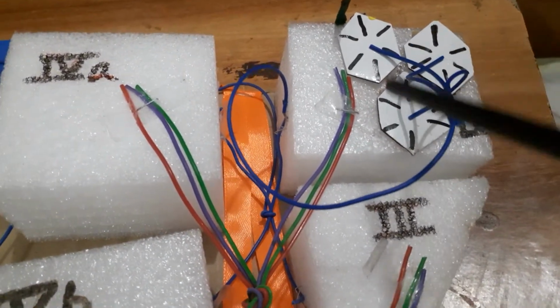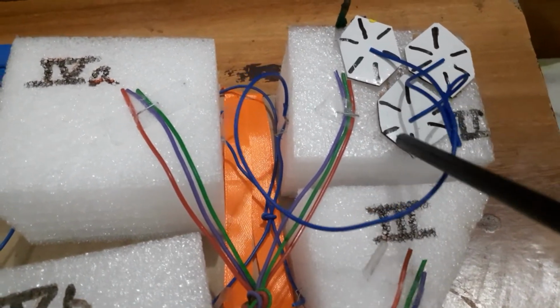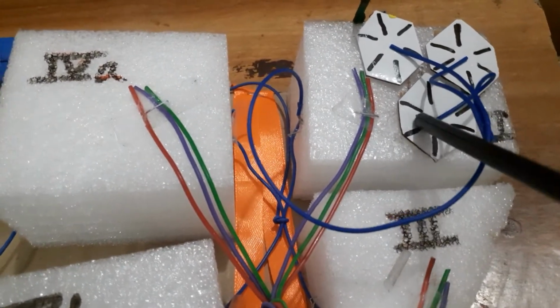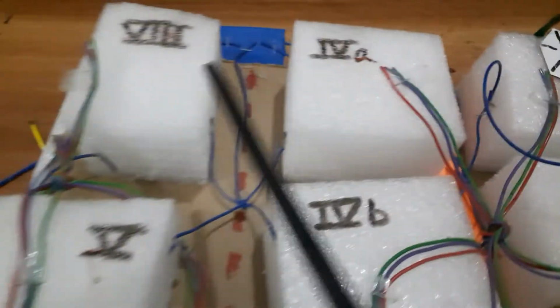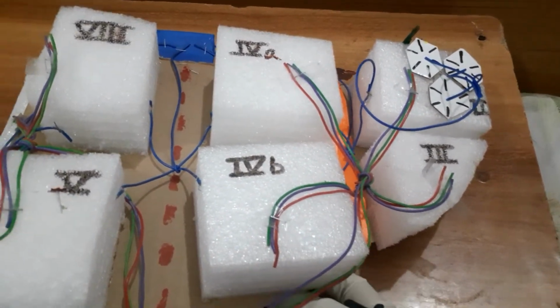And now they are coming into the segment where many much classical hepatic lobules are there. These are the hepatic lobules in which hepatocyte lies. Okay, these hepatic lobules are millions in number in whole of the liver. Okay, now coming to the inside structure of a hepatocyte.